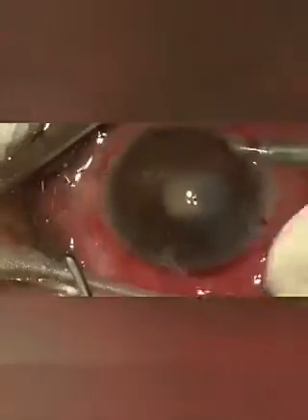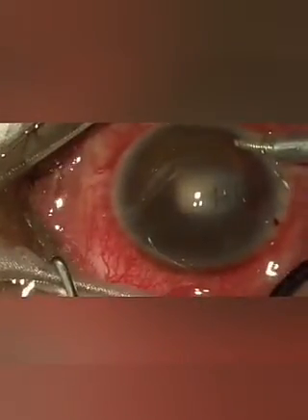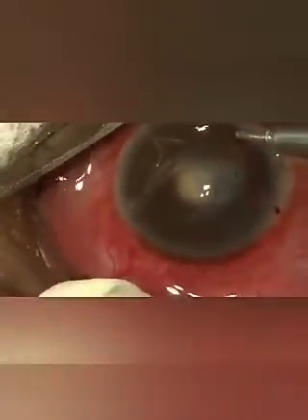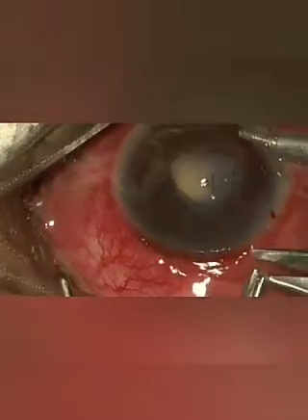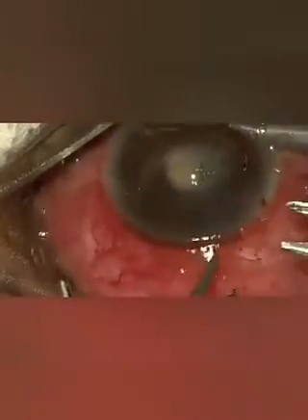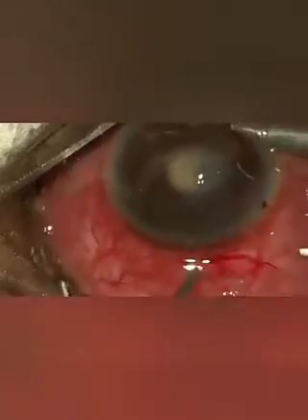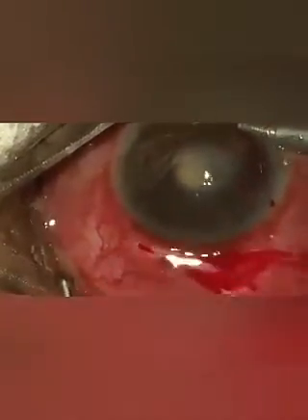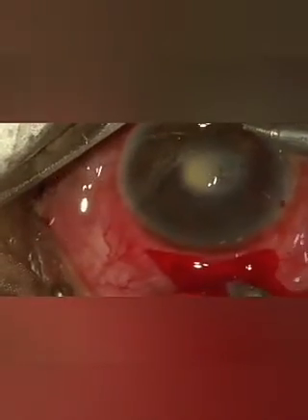The intraocular maneuvers in the management of traumatic cataract occur entirely in the anterior chamber. Therefore, it is essential to maintain the anterior chamber depth throughout the procedure. A shallow anterior chamber depth can be detrimental to the iris tissue, posterior capsule and the capsular bag, which can increase the incidence of intraoperative complications.